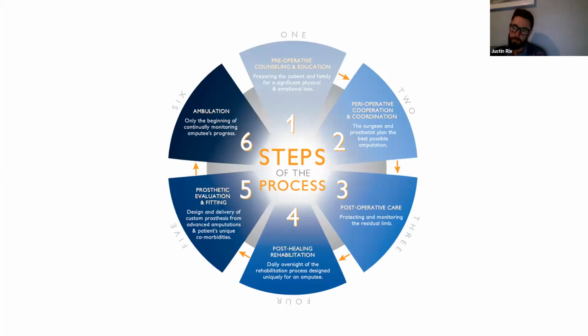Step 5, prosthetic evaluation and fitting. So working with the patient's existing comorbidities to design and deliver the correct type of custom prosthesis for their daily needs.